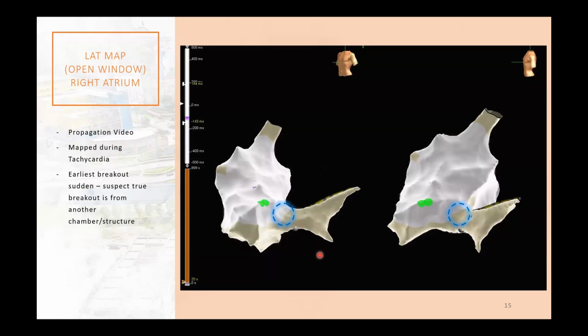Asking me? Yes, asking you. Okay. MCV, there's a golden rule of MCV ablation. First of all, I saw a bunch of that in there, so I hope you did not ablate the os of the MCV. The MCV is a vein that is relatively much thinner compared to the coronary sinus from a muscular standpoint. In the old days, we used to ablate inside the MCV and invariably caused a significant stenosis. Fortunately, MCV stenosis really doesn't cause too many hemodynamic consequences, so we don't worry about it.